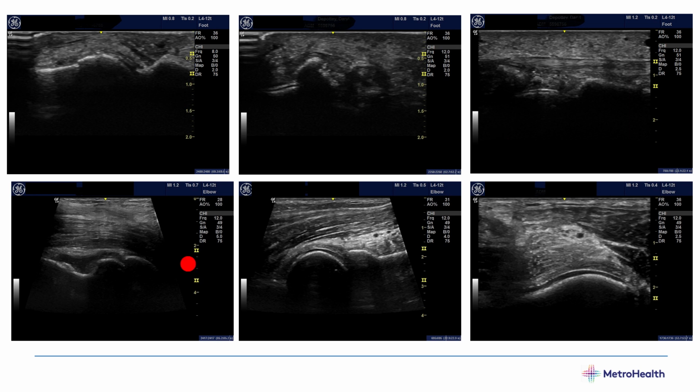His elbow shows a little effusion. This is the anterior long view over the radial side, and you can see this line, which I'm calling a double contour, that I can even see on the anterior transverse of the elbow. This line here that I'm calling double contour.